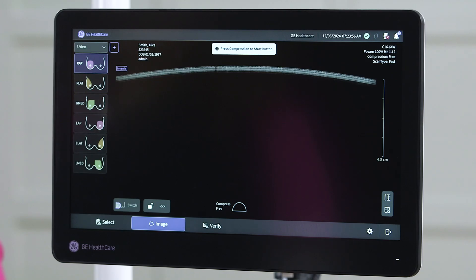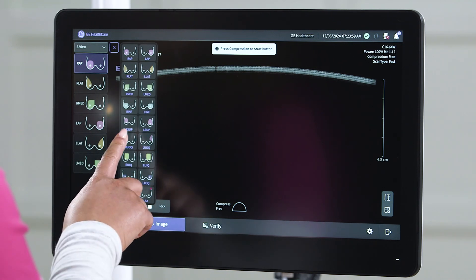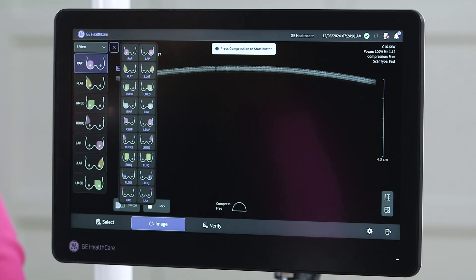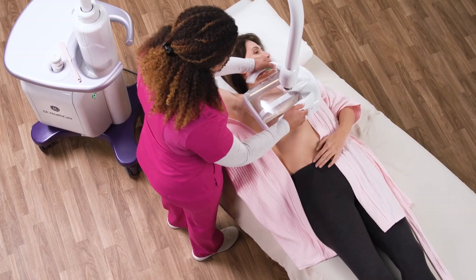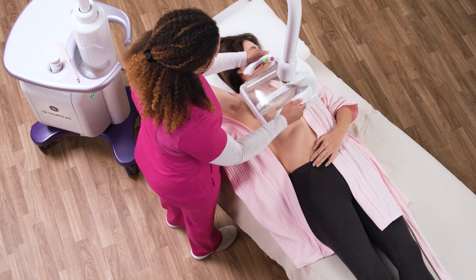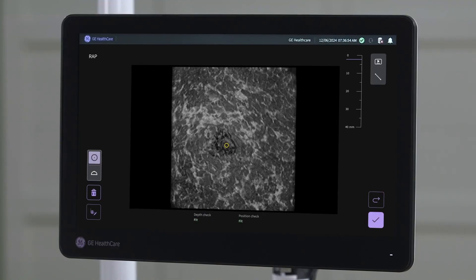With intuitive graphics, users can customize protocols, and additional views may be taken for larger breast sizes and implants. For patients with smaller breast sizes, the acquisition can be shortened with the stop scan feature. After the acquisition is complete, a coronal view is displayed.